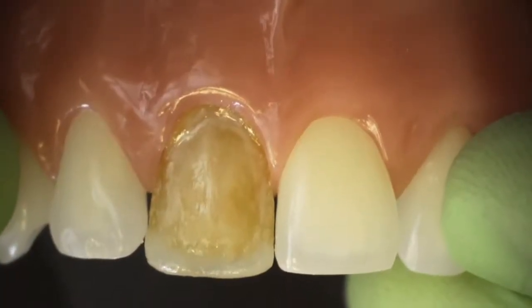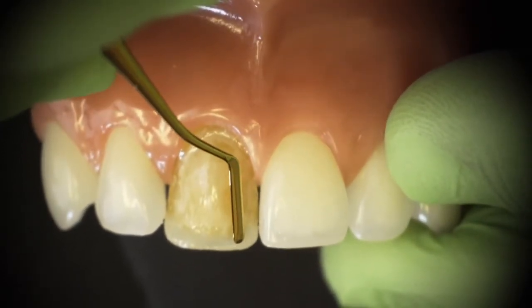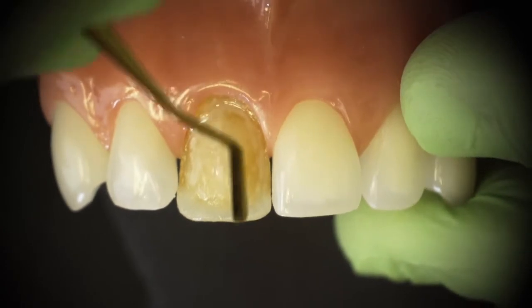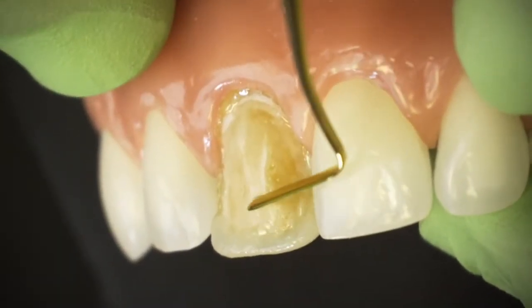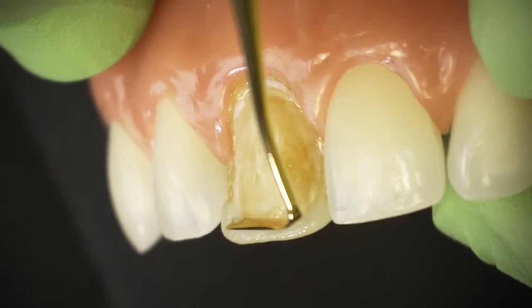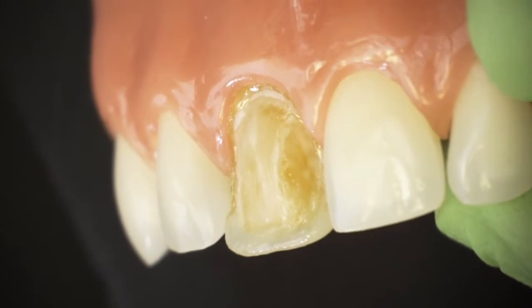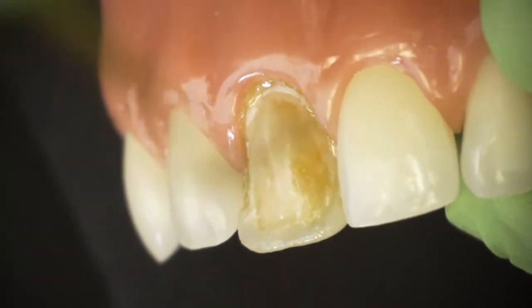Before I cure this layer, there are several things I want to evaluate. I'd like the length to be about the same as the adjacent tooth — it's fine if it's a little longer because I can adjust that down. I prefer not to be short because I need this nano to protect the incisal edge, since my microfill is going to be filling in that area. As we discussed in the lecture, microfill doesn't have the same strength as nanofill or hybrids. I also need to make sure there isn't any excess composite over the facial wall, because I need as much space as possible to block out that darkness. If I have this translucent material coming over the facial wall, it's going to allow that darkness to shine through. So I have to make sure I'm going just up to the incisal edge and not taking up any space where I need to go in and opaque.